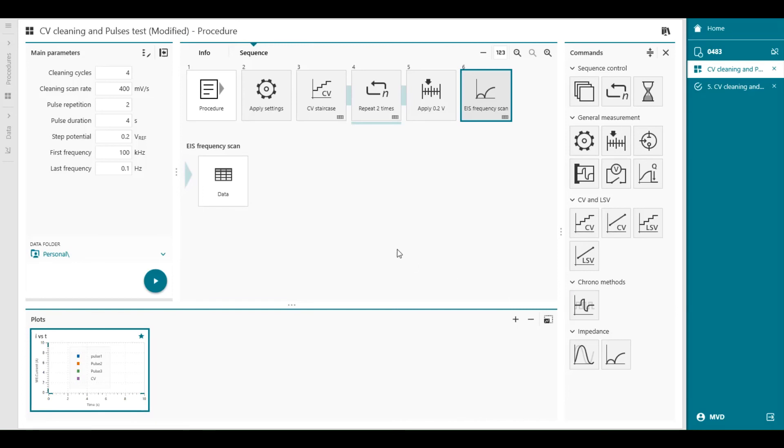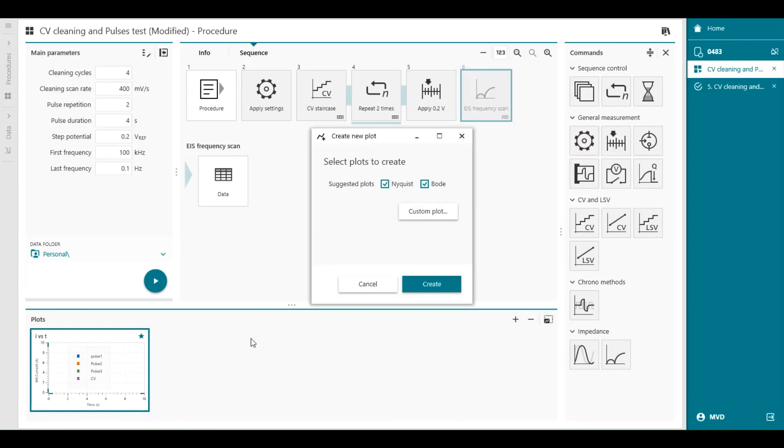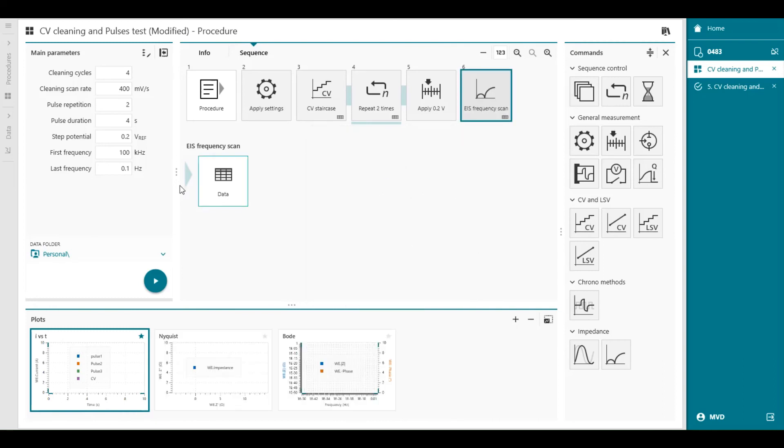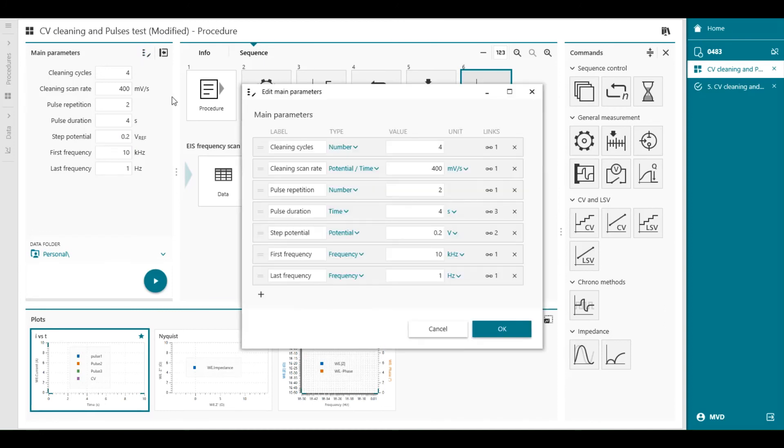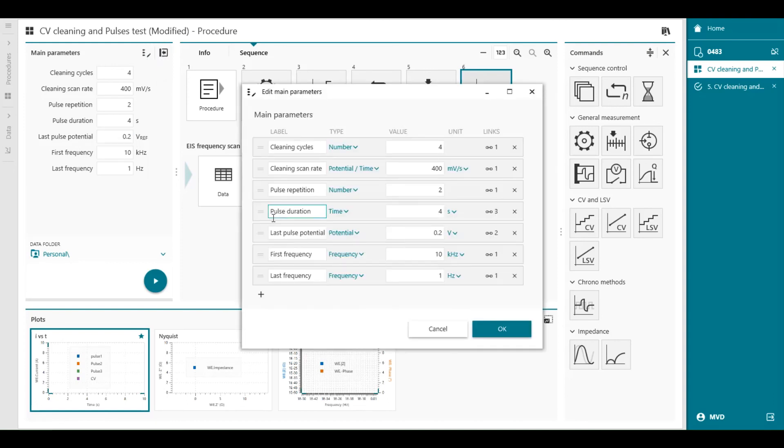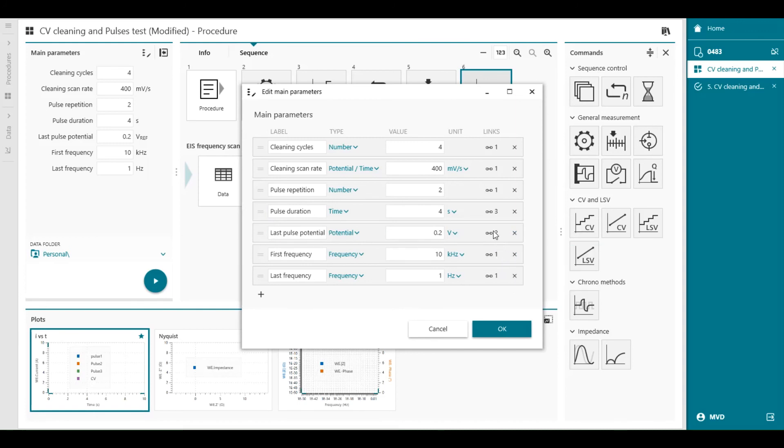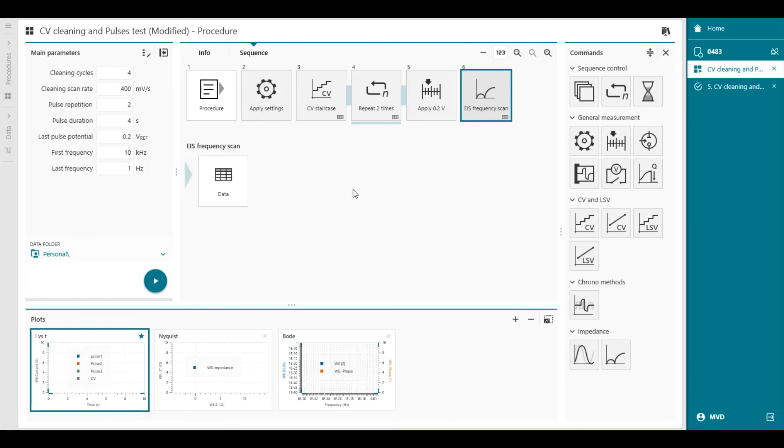We can add the plots of the frequency in electrochemical impedance spectroscopy frequency scan to the plot ribbon, like this. And it's already suggested to the Nyquist and the Bode plot, we create it. We modify the first frequency, let's say 10 kilohertz to 1 hertz. And the step potential, apply potential, we can modify the name of that last pulse potential, which is linked to also to the set potential of the impedance measurement, as you see here. So you can design any type of procedure with the commands on the right side of the window, in combination with the procedure editor.